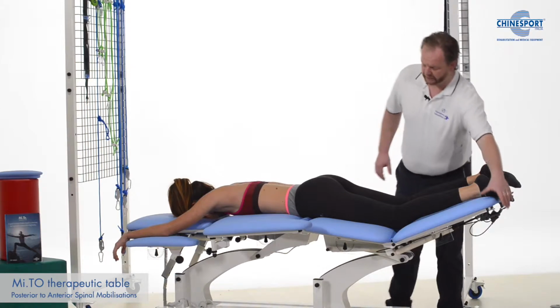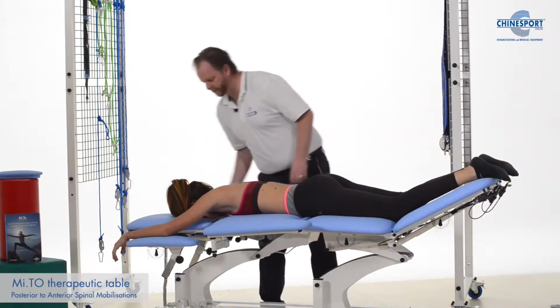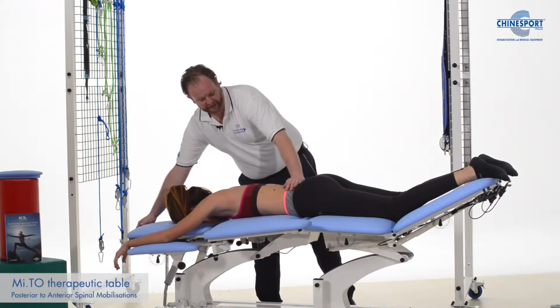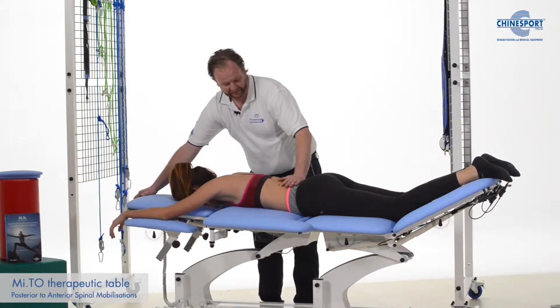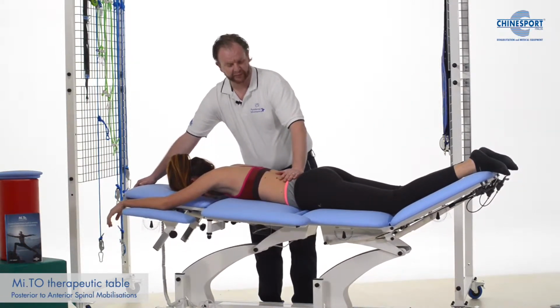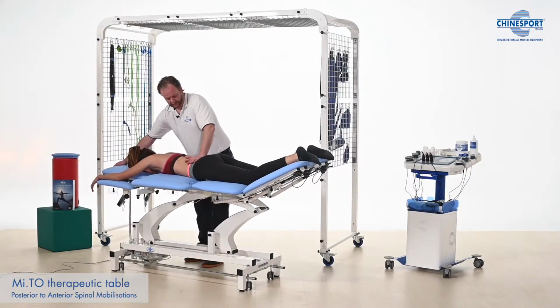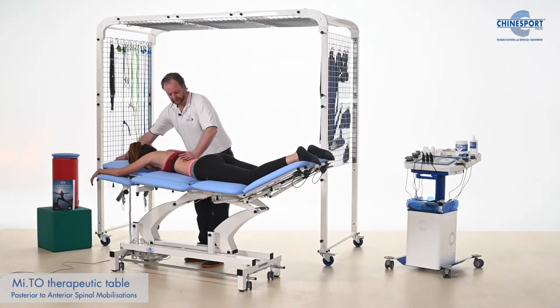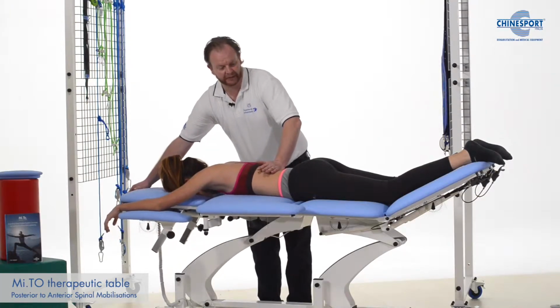Sometimes we would like to have some extension. For example, if we're using the Mackenzie principles, then we can simply use the thorax segment that we're moving up and down. I'm just going to adjust for my back as well. And then we can block certain segments to create more movement. We just move up and down into flexion and extension maybe.